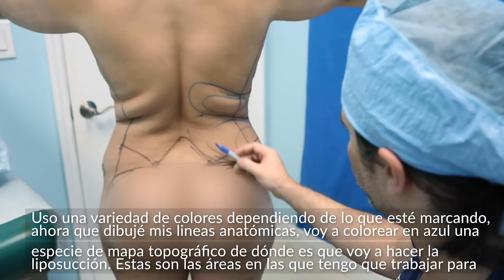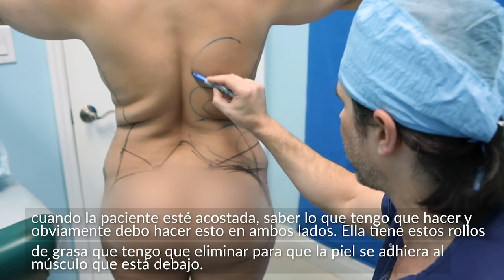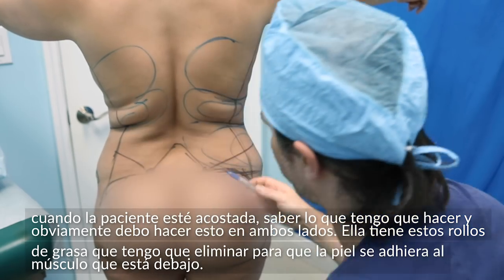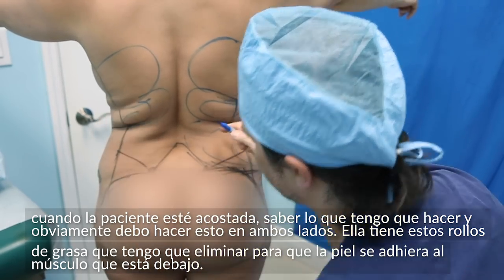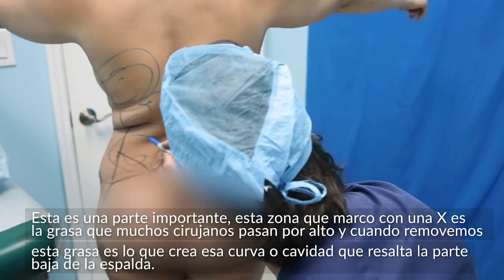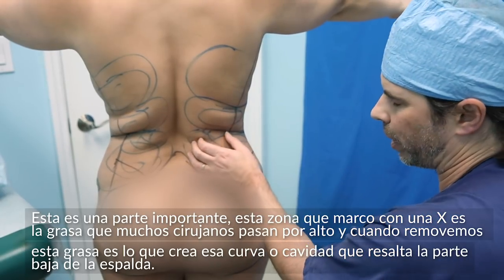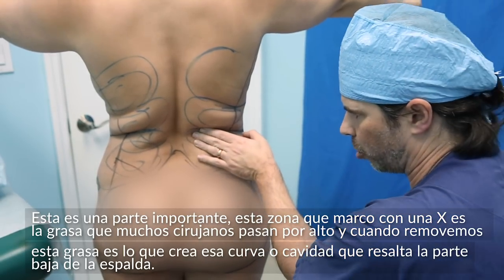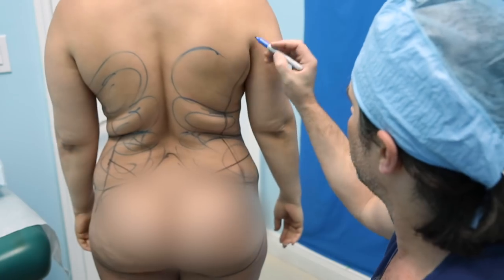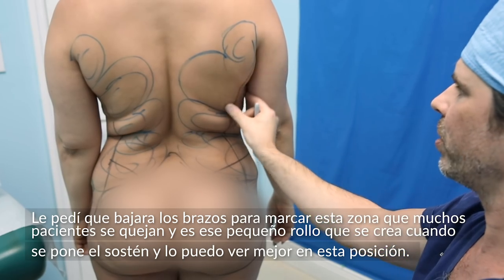I kind of outline the areas which are deeper and greater with my pen so that when I'm on the table, I know exactly what I'm doing. She's got these little rolls here which I really need to thin down — this is the most important part. This fat right here where I have this X marked is really important. A lot of surgeons miss this. Bringing this in really creates that curve and that concavity of the lower back. And with the arms down, I'm getting this little bit of stuff people always complain about by the bra roll, which I can see better in that position.